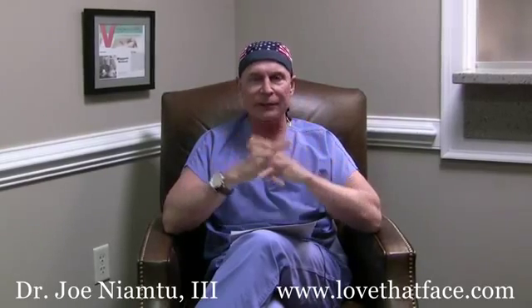Number one, you're going to be sedated, and we're going to make a controlled burn on your skin with the laser. There are various depths that we go, and most of these will heal in a week to 2 weeks. Most of the lasers that we do are aggressive, and they take almost 2 weeks for the initial healing. When you wake up, your face is going to feel warm like a sunburn, and I've been through this. You're going to have a coat of what we'll call grease on your face, and that could be Vaseline, Aquaphor, or some of the other products that we'll discuss.